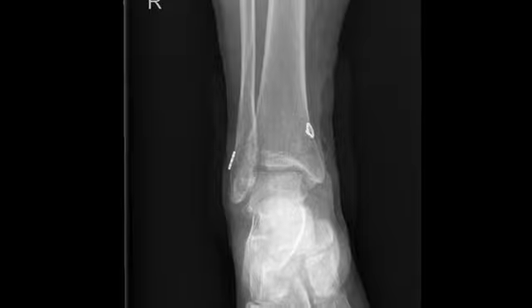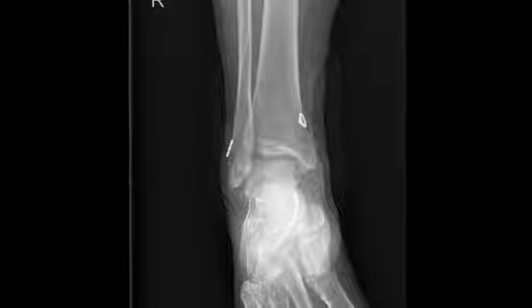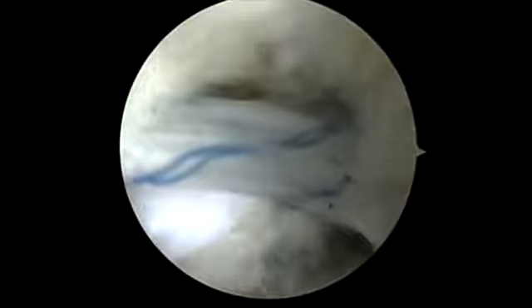In the next step, dynamic tibiofibular stabilization is performed using 2 hi-fi tapes and plates. Scan shows the input direction of the hi-fi tapes through tibia and fibula with endobutton plate and washer plate at the opposite ends. After stabilization is achieved, a knot pusher is used to tie the AITFL sutures.